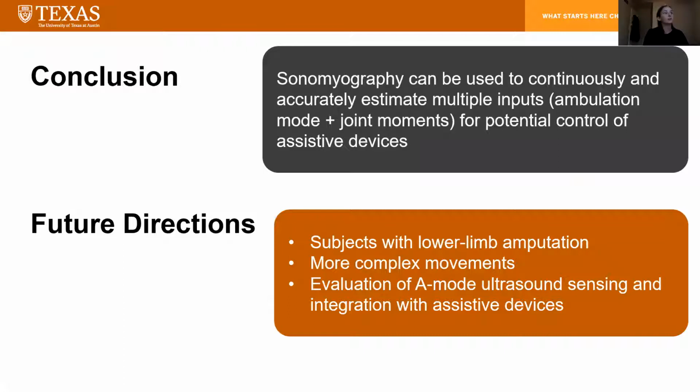In conclusion, sonomyography can be used to continuously and accurately estimate multiple inputs for potential control of assistive devices, and future directions will include subjects with lower limb amputations, more complex movements, and the evaluation of A-mode ultrasound sensing, as well as integration with assistive devices.